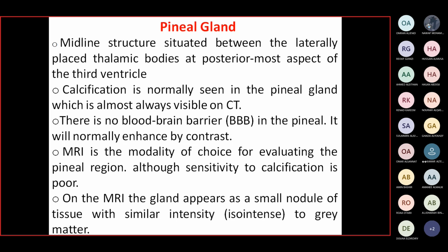This pineal gland is normally calcified. What is the best imaging modality that can demonstrate calcification? CT. Yes, and to a lesser extent, what other? X-ray. All right, thank you. But MRI is very poor in demonstration of calcification. Calcification in the pineal gland is almost always visible on CT.